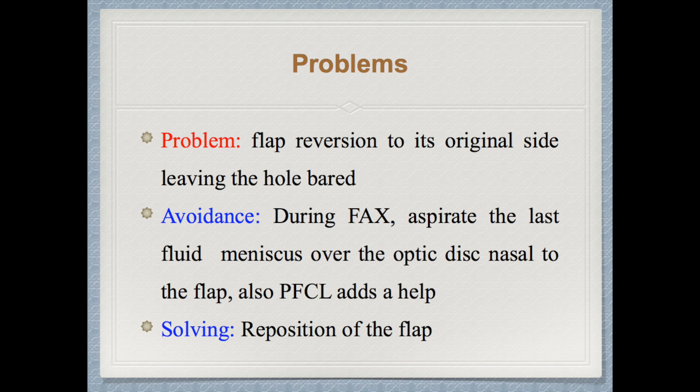To avoid this problem during fluid-air exchange, aspirate the last fluid meniscus over the optic disc, nasal to the flap. This helps to create traction forces on the flap and keeps it inverted over the surface of the macular hole. PFCL can also help. If this happens anyway, simply reposition the flap.